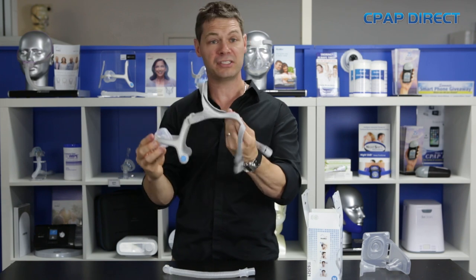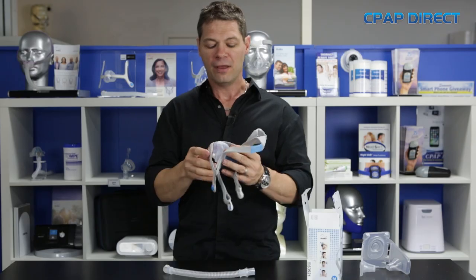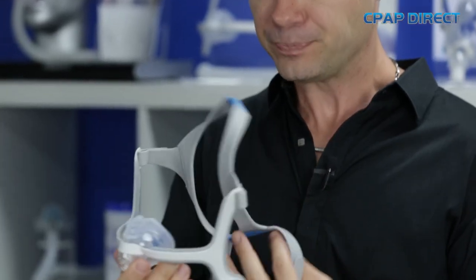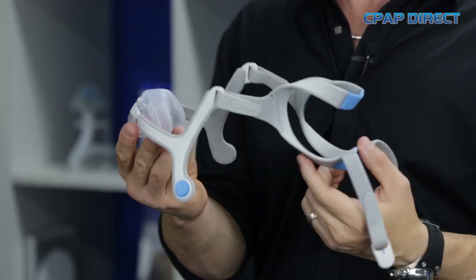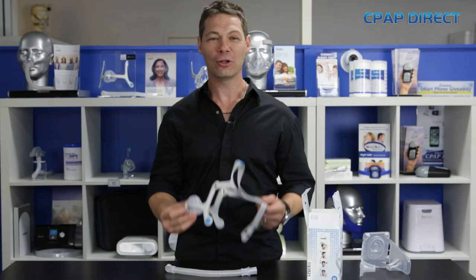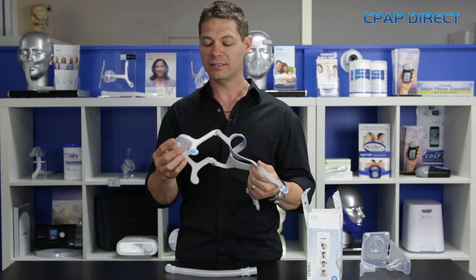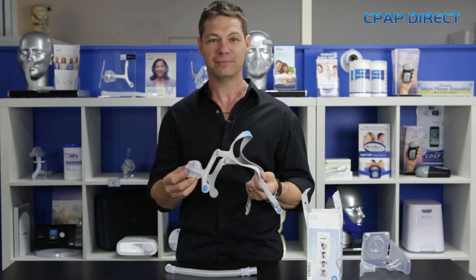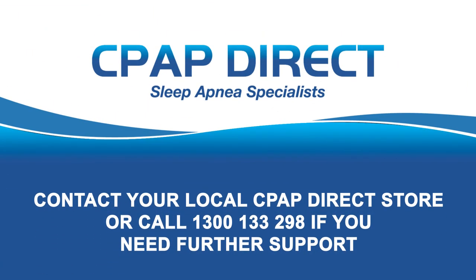Great for somebody with a standard size head, but just make sure you check that first. Very comfortable mask to wear. Exit air still comes out of the front — they haven't found a way to completely diffuse that. All in all, comfortable mask, 100% better than the N10, and I think it's going to be a real winner for ResMed. Thank you.